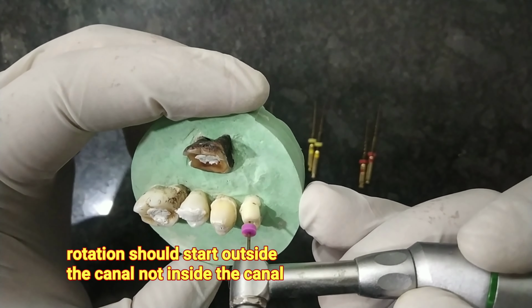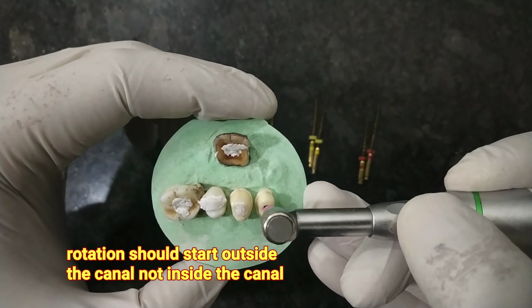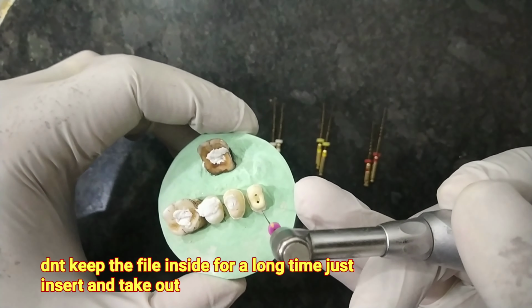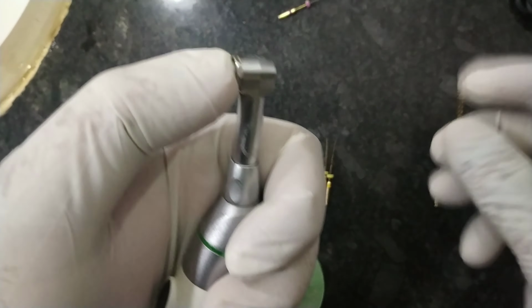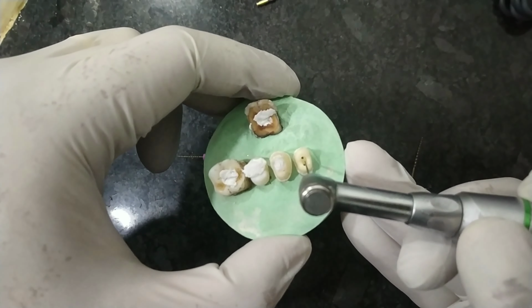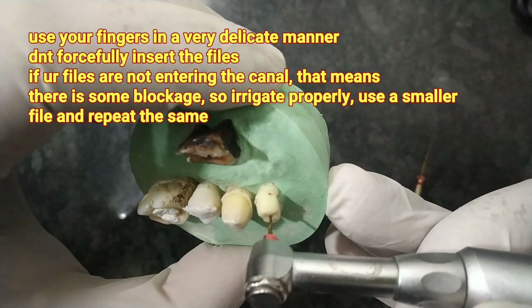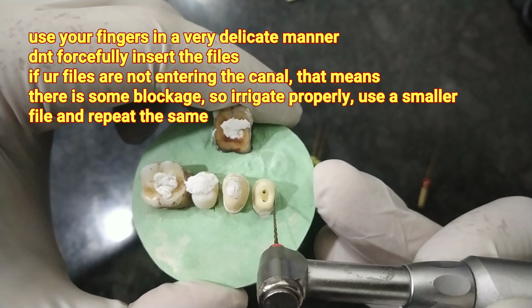What is the advantage of rotary? With rotary RCT, you can do the root canals very fast because you are not using your fingers, you are just using your wrist. Just a motion like this. Since I have already prepared the canal, it's rotating freely. For example, I want to show you the auto reverse function. Directly what I'll do is I'll fit the 4% 25 file in this, and see whenever the canal is getting some kind of obstruction, it's getting auto reversed. I put it in the buccal canal, now I'm putting it in the palatal canal. See, it's getting auto reversed if it is getting some kind of binding or obstruction.